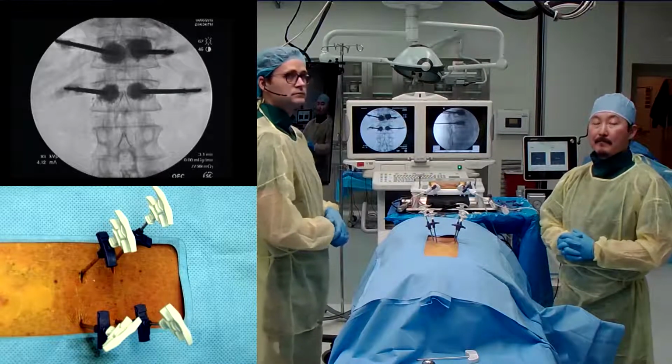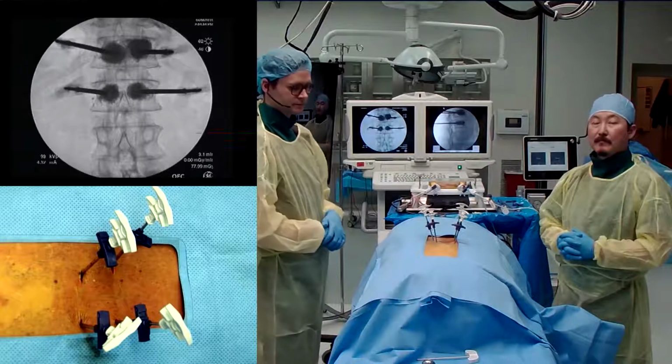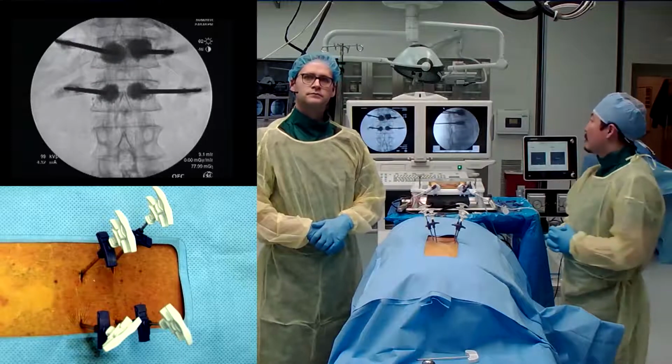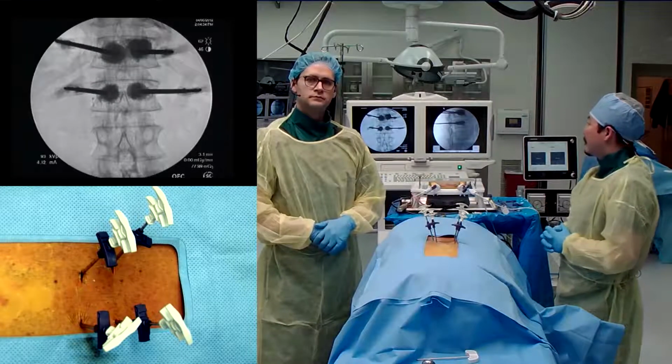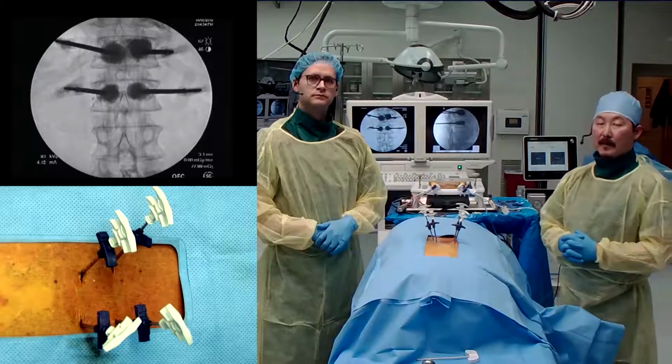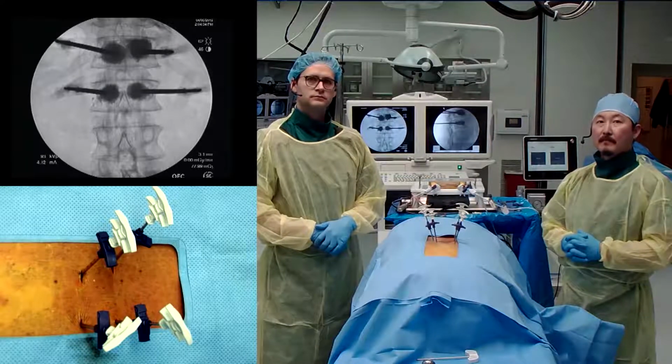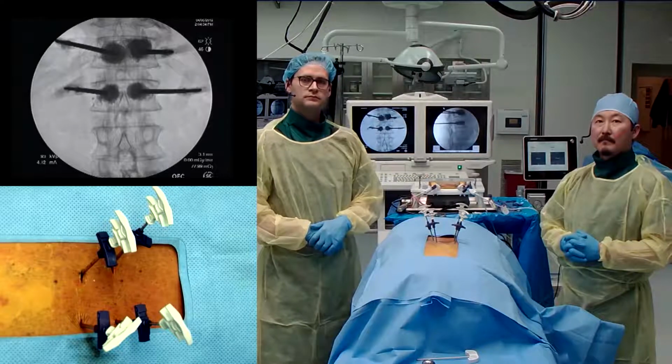So cement migration into the canal, you have to watch for it. Sometimes it's behind the needle. You see how when they were injecting the cement, you kind of couldn't see it, and boom, the next thing, it's right there. Yep. Sometimes you can see that the cement kind of goes behind it. You have to be aware of it. Look behind the needle and see if the cement is there.